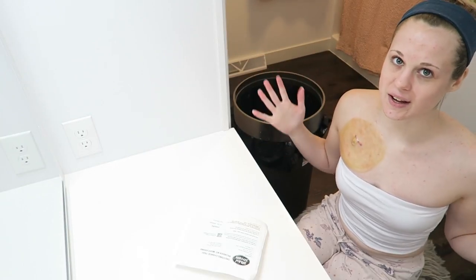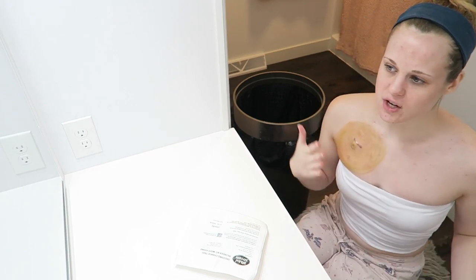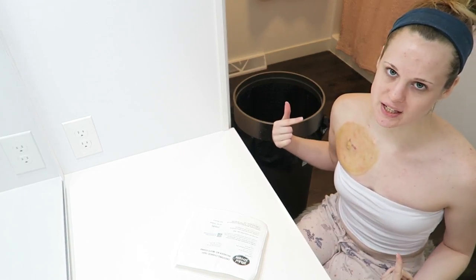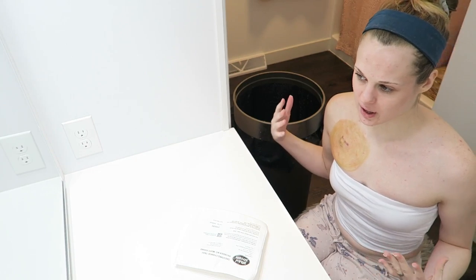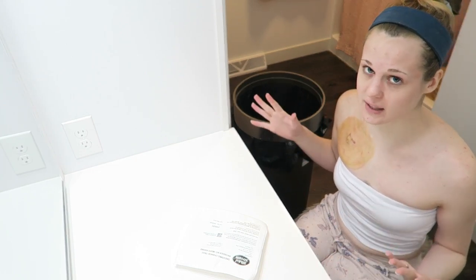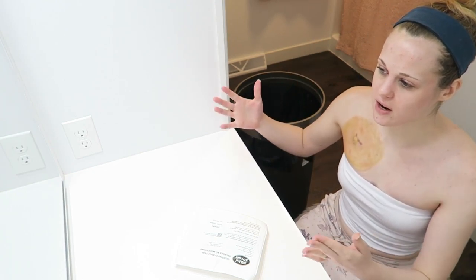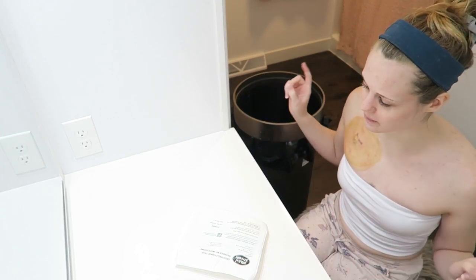Another thing I just caught myself doing, I was gonna try to dry my hands off. Never wave air towards your port to get it to dry. Don't ever access your port or do anything with your port with a fan on. You don't want a bunch of drafts moving. That is because air moving into the port can actually cause bacteria to float into the port, which is not good.